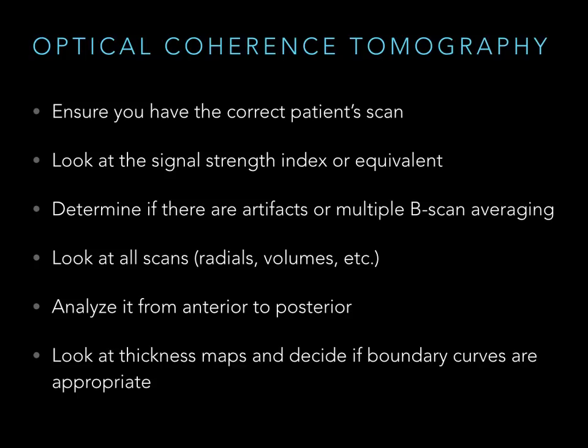The worst thing you could do is have somebody coming in and you didn't give them an injection the time before because you thought they were normal. This time they definitely have fluid. You look back, there was fluid last time and you missed it. Okay? I've seen a lot of patients where I'm seeing them for the first time, and I cannot tell you how many times I've seen that in the last 6 months. And it's really sad. Vision does not get better when they've got fluid under their retina or in their retina.